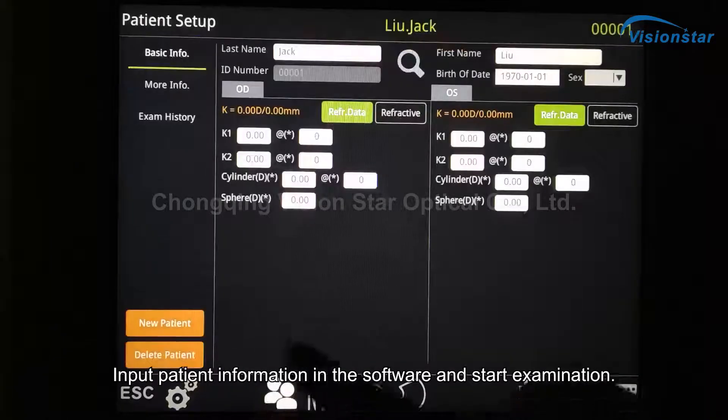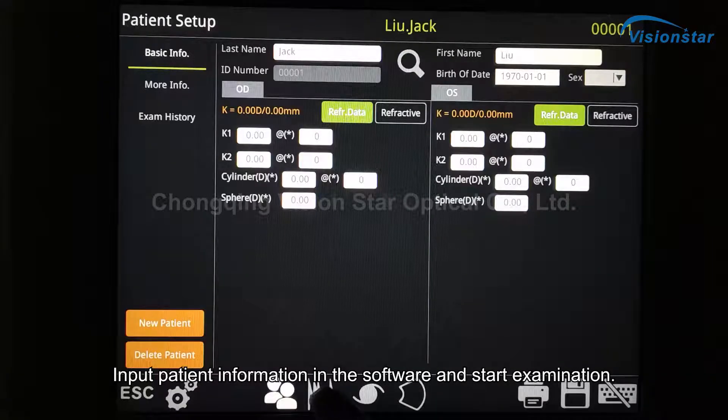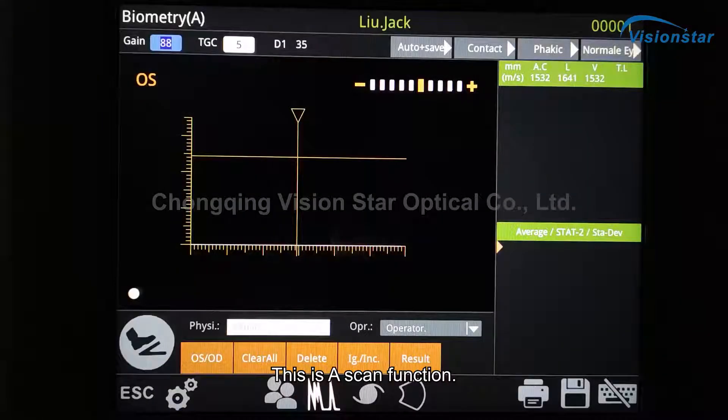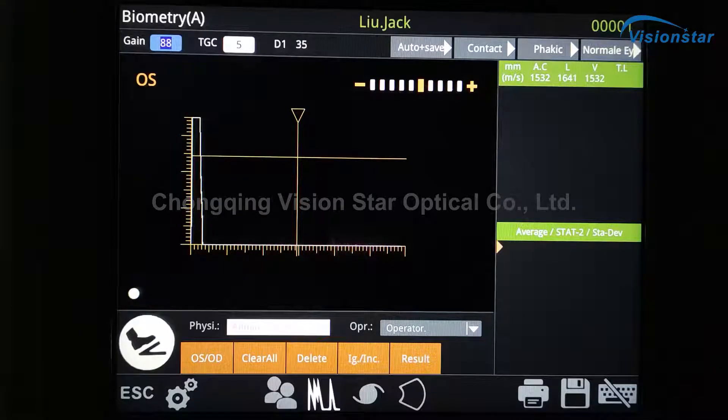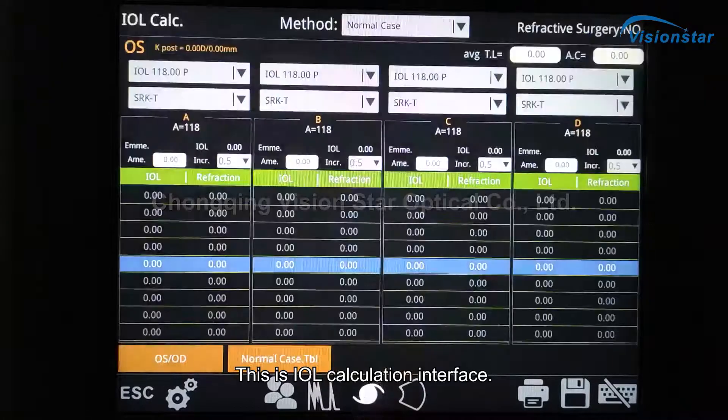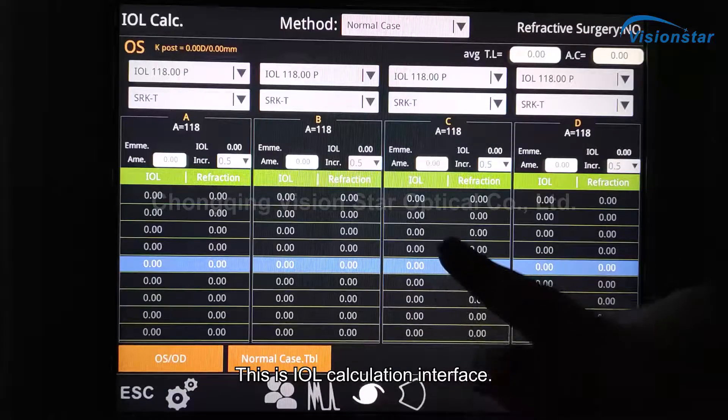Input patient information in the software and start examination. This is the A Scan function. This is the IOL Calculation interface.